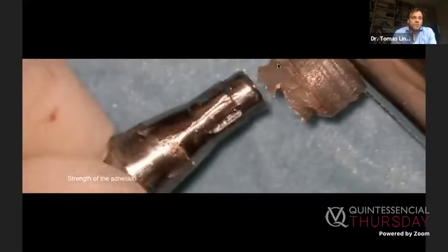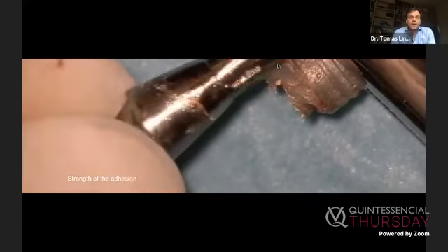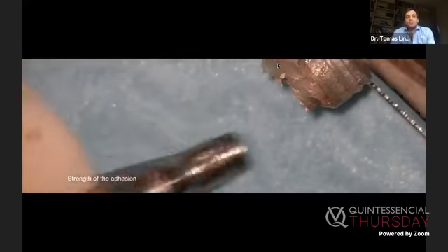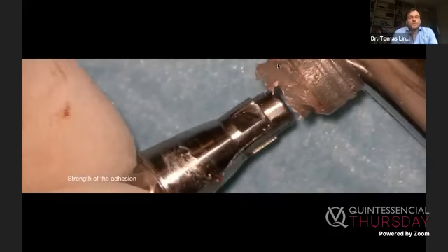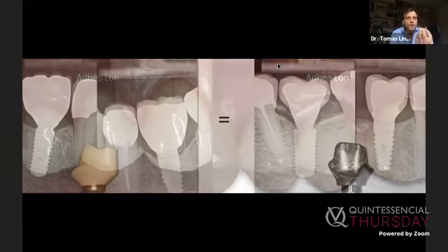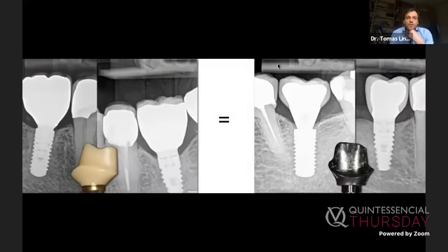So apparently, we start to think about what kind of material has the least attraction of plaque, and also other qualities to develop stability of the tissues. Now, this is the ultimate goal, to have adhesion. And I consider this contact of the tissues to the surface of the abutment an adhesion, a gluing. Like you glue two pieces of glass, you have glass, you have water and another glass. And if you glue them together, then you cannot separate them, co-adhesion. So this is how I think the tissues should adapt there.